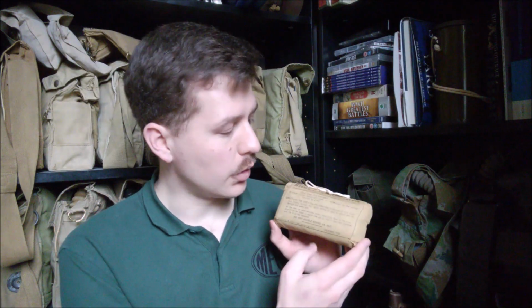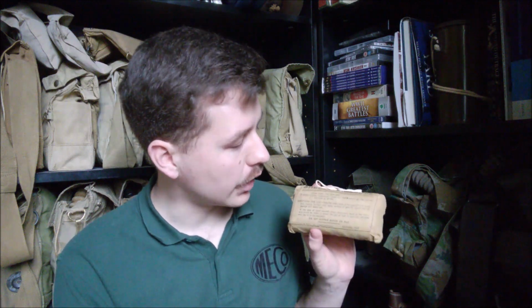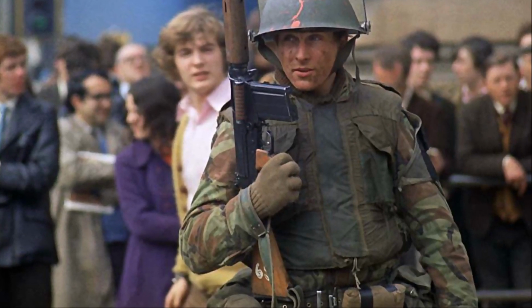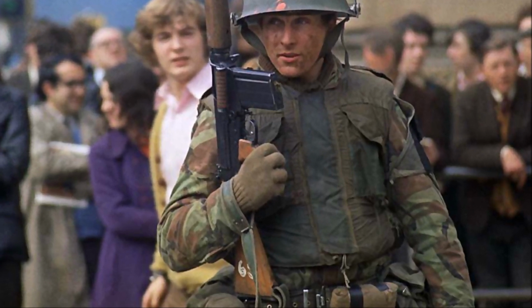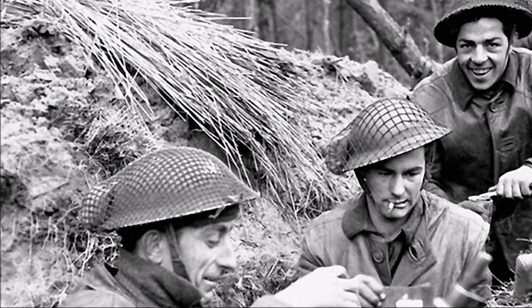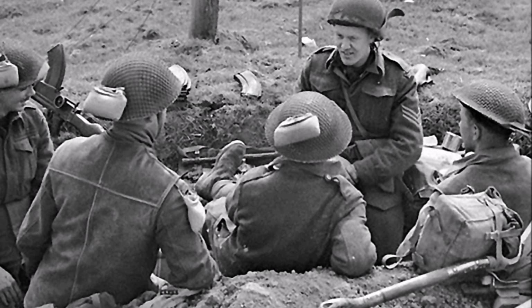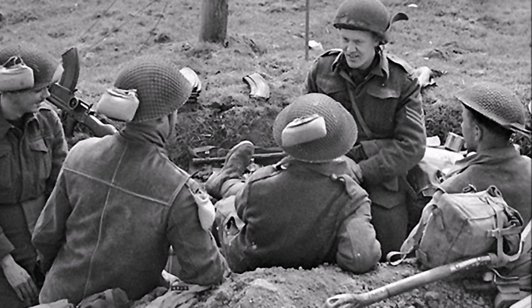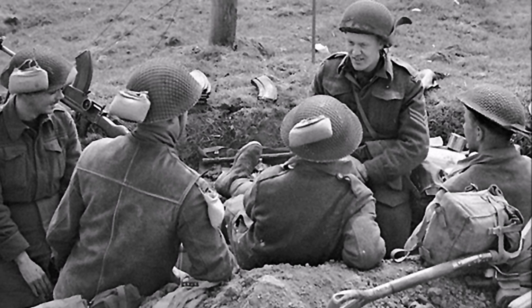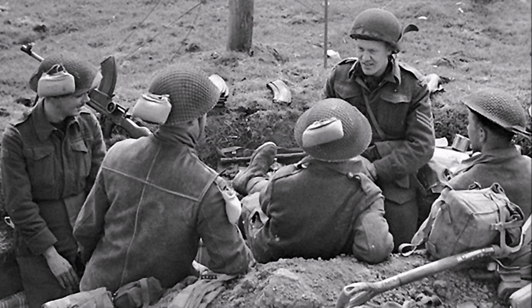And these, of course, were certainly issued to a degree as personal issue, although the first field dressing was really intended for that. It's a larger dressing. The first field dressing contains two small dressings. This is one larger dressing. As I say, during the Cold War era, it's not unusual to see these taped onto belts or other parts of web equipment, or even rifles. And during the Second World War, prior to that, of course, you do see photographs occasionally of these tucked under helmet nets, and pieces of equipment, pieces of clothing, such as the trousers parachutists had, two pockets in the rear designed to each hold a shell dressing. So some personal issue there, as well as being issued in, as we'll see now, shell dressing bags.